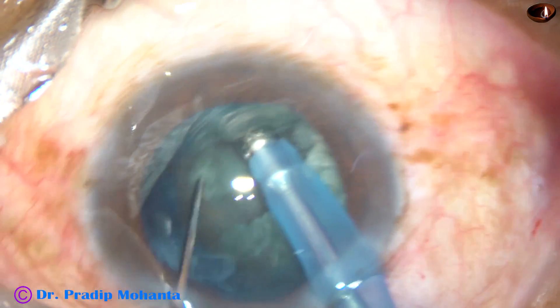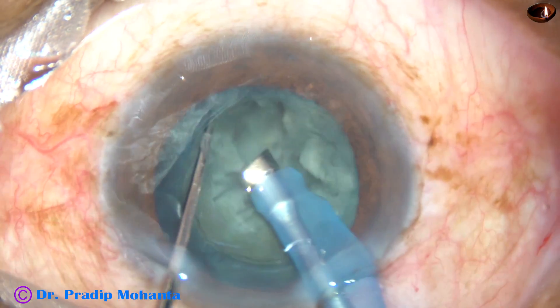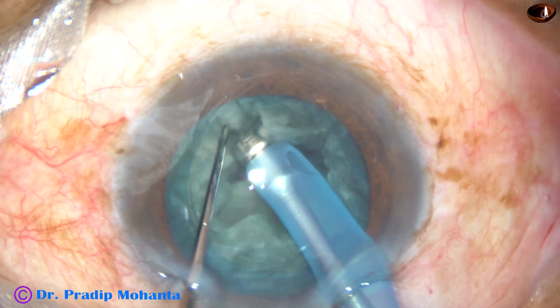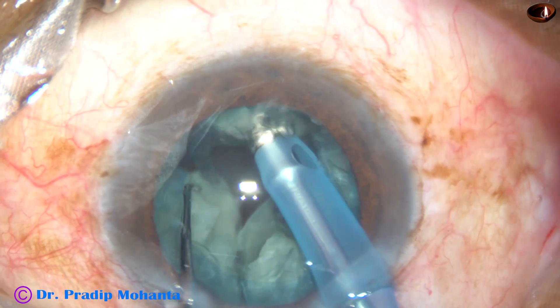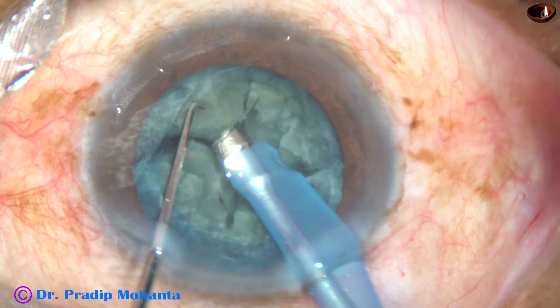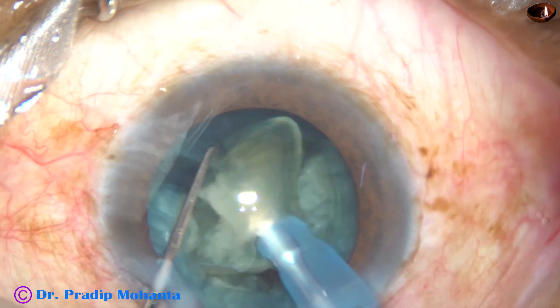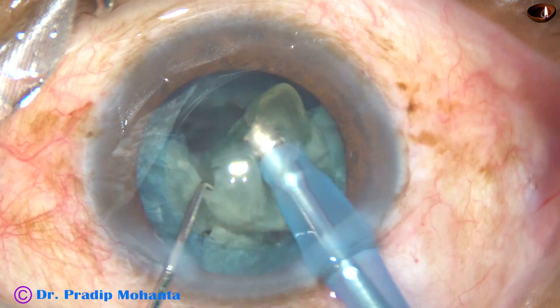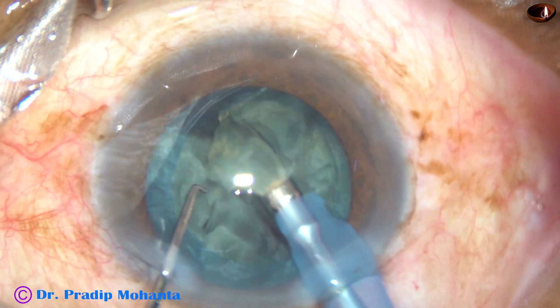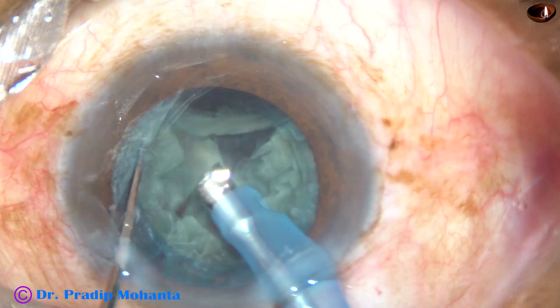See how to engage and use your chopper to crack this. If you don't find it comfortable, you can come out, inject Viscoelastic, and use two instruments like two choppers or two Sinski hooks to crack this. But it is recommended that you learn to crack without coming out. With your phaco tip and the chopper, learn to crack.